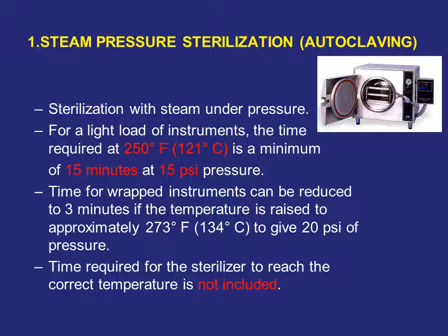The time required for the sterilizer to reach the correct temperature is not included. This means the time the sterilizer or autoclave takes to reach the required temperature is not counted within the sterilization time.